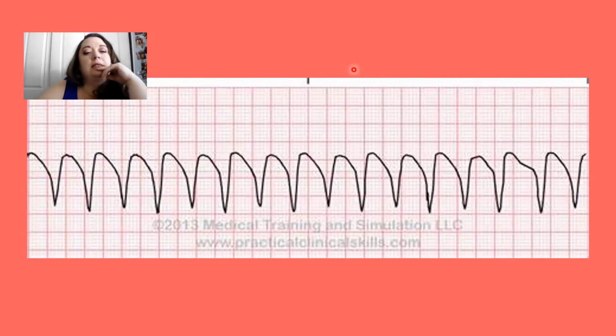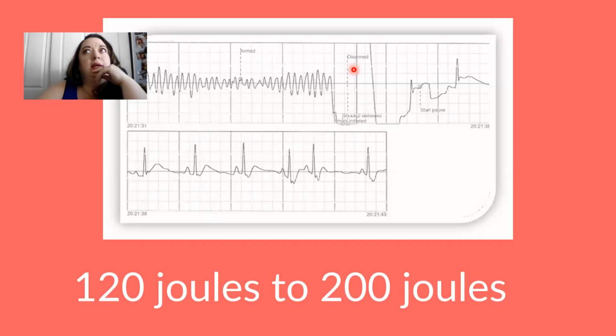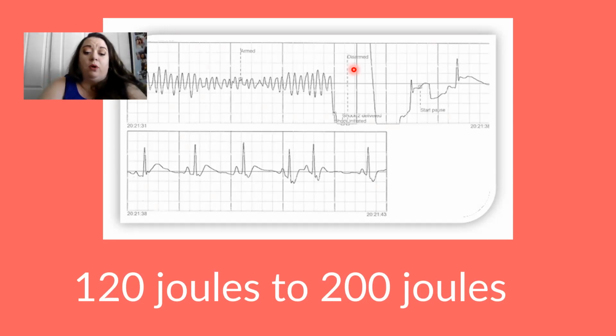Any questions on VTAC? Can you give amiodarone for VTAC? Yes. We can do one round, I think, per ACLS. I think you do two rounds of epi, and on the third round we can give amio. I'm like 90% sure on that. We don't tend to give a lot, but it's a good medication. We've probably used more of it, but let's see.